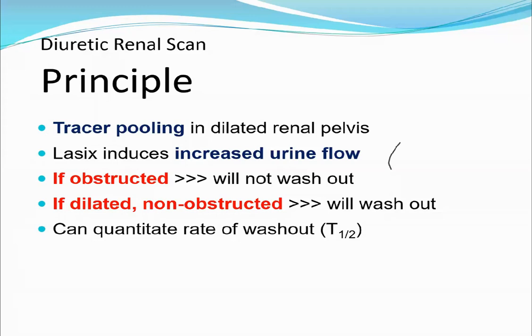In the case of minus 15 minutes, the diuresis will widen and affect the blood osmolarity. So we use plus 10 minutes, in which we inject Lasix 10 minutes after the beginning of the study. And we can calculate GFR in the first 2 to 3 minutes.